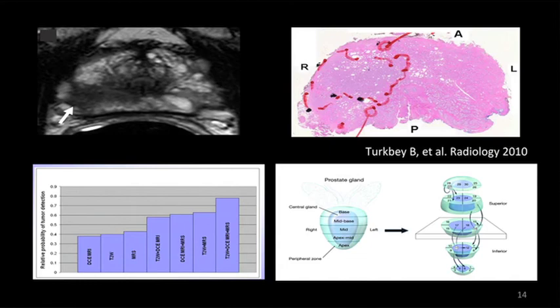In most of the patients, what we see on MRI, as you can see here in the right apical peripheral zone, was not matching well with the pathology. But we were quite confident that this lesion corresponded to that in the pathology. And then we used a neighboring approach to overcome this problem, but this obviously diluted our results. So we realized that the prostatectomy specimens were not being handled and processed properly.